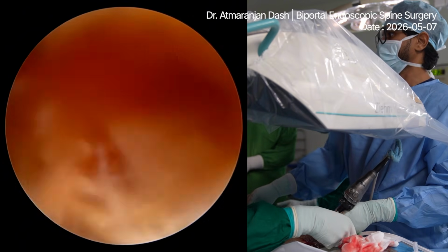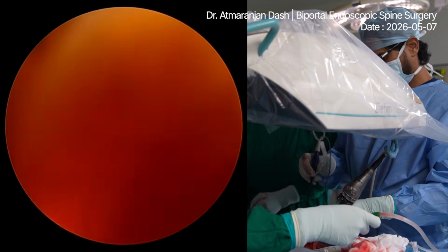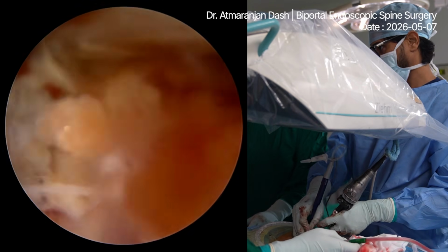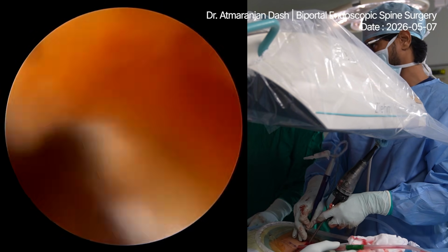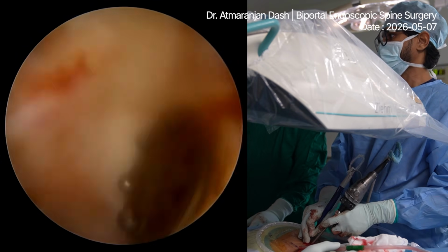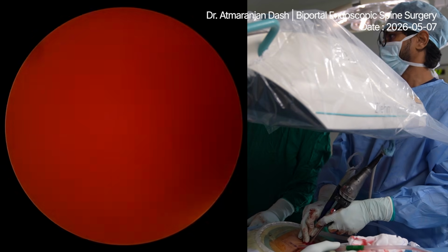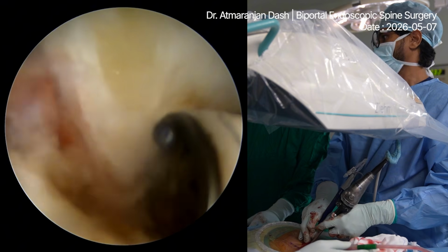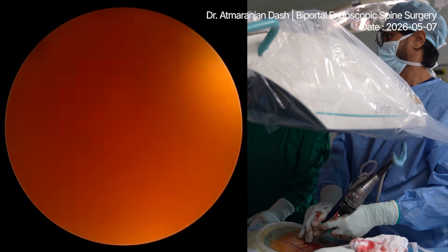Coagulation. So a lot of oozing does happen, which has to be taken care of by generous saline, generous ablation, coagulation.